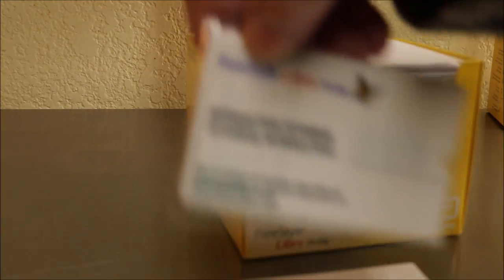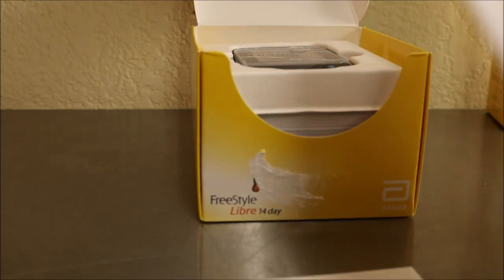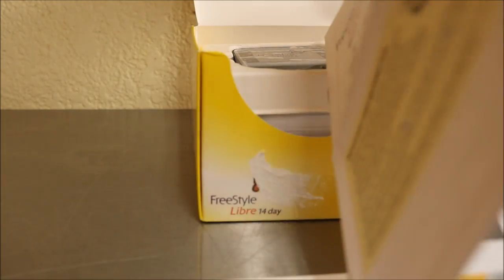I bruise on my fingertips so I don't want to stick them anymore. Here's the reader — let's open that first. There are little books inside; this one's not in my language. There's an interactive tutorial USB, a big book, and one in Spanish. The quick reference guide is for me — it's a little booklet that tells you how to install the apparatus on your body and how to use it.